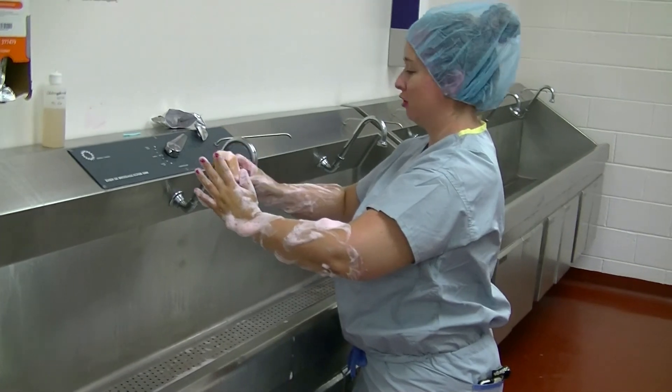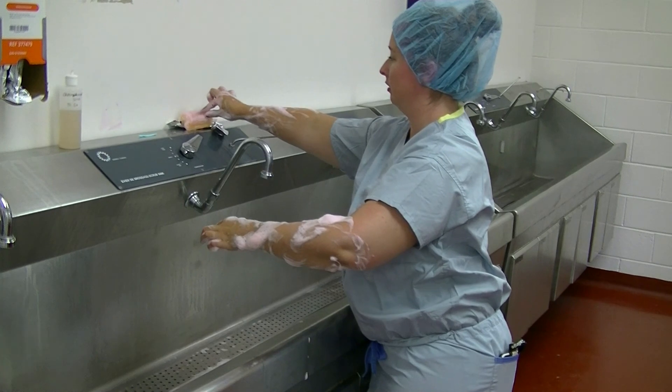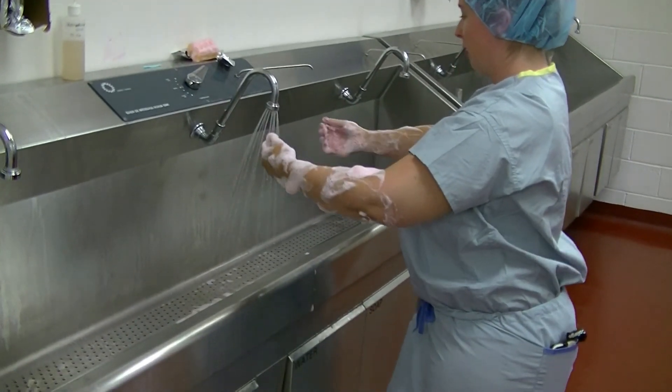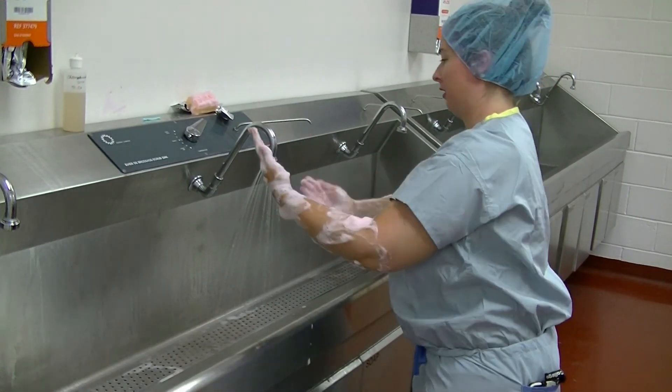When you finish your scrub, you can either drop your scrub brush back into the sink or place it on top without touching anything non-sterile. Turn your water back on and rinse — your fingertips always have to stay above your elbows while under the water.